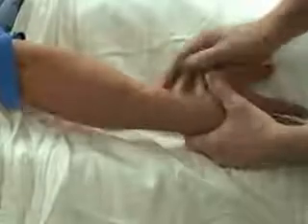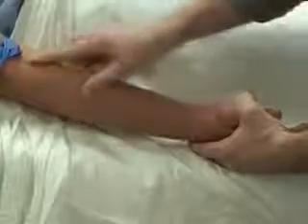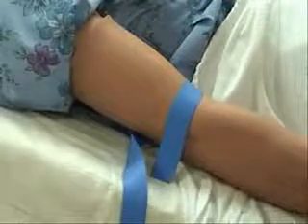You can also check the forearm and the antecubital, as well as the other arm. Be patient. Finding a good vein can take a while. Once you find a good vein, you are ready to start your IV. If you didn't find a site right away, you should untie the tourniquet for patient comfort.